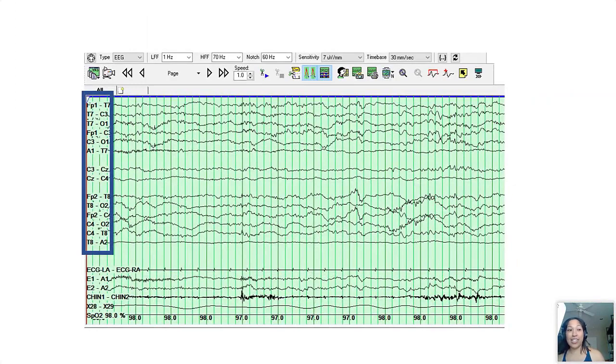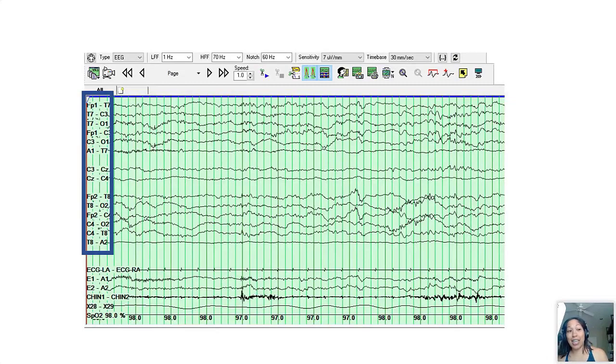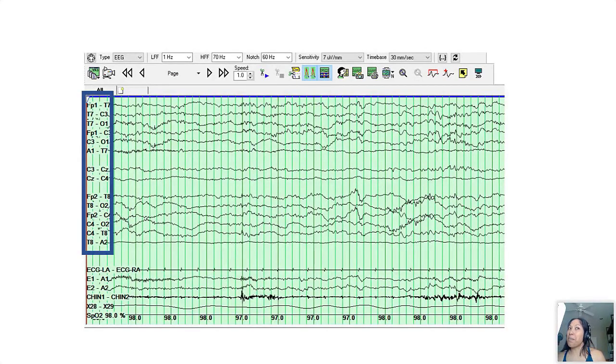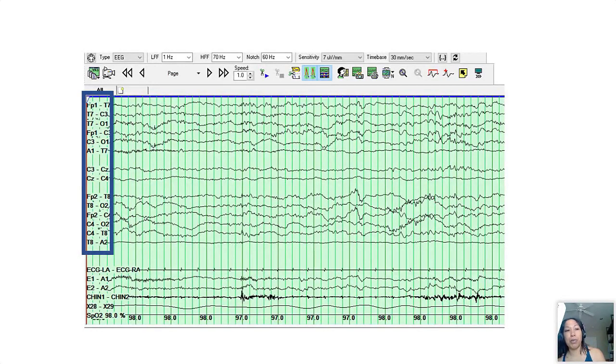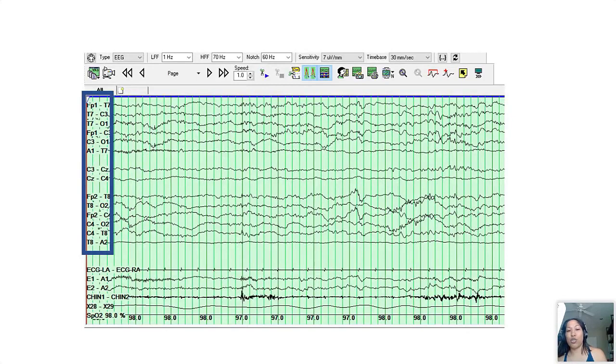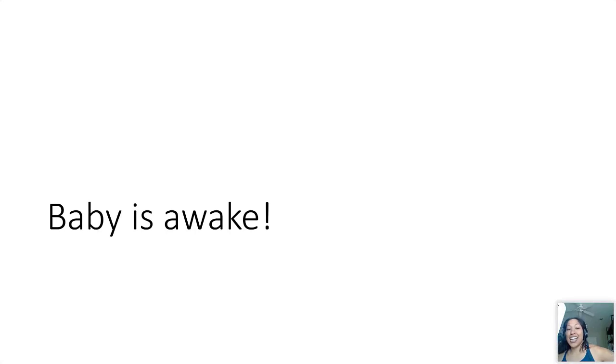And along those lines for readers who maybe don't see a lot of neonatal EEGs, I just wanted to show this example of what a neonatal montage might look like on the EEG. It's a bit different than the standard double banana. We can do a bipolar montage, we include the ear reference to handle the end of chain, and this is what a standard neonatal EEG would look like.